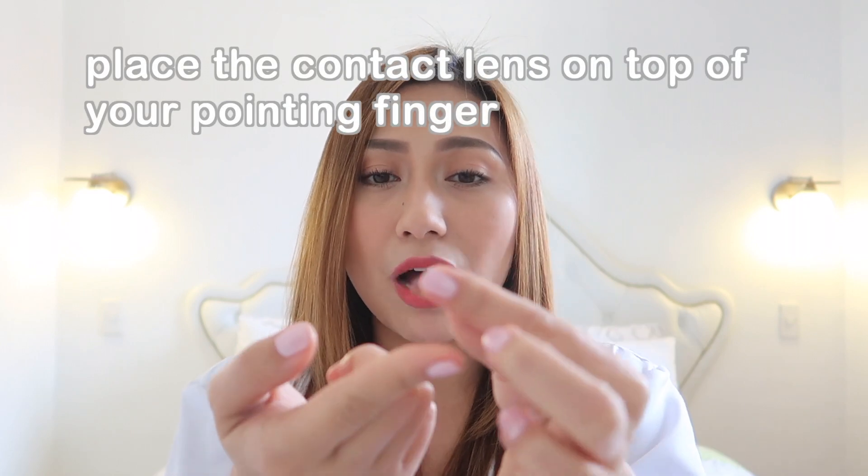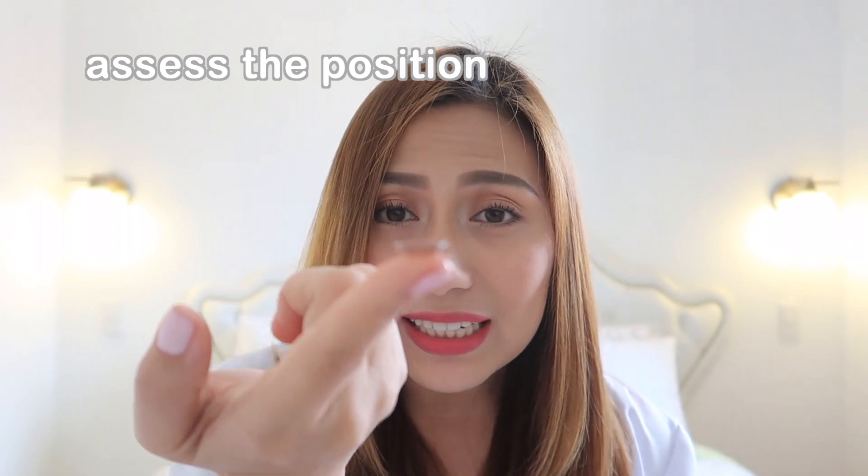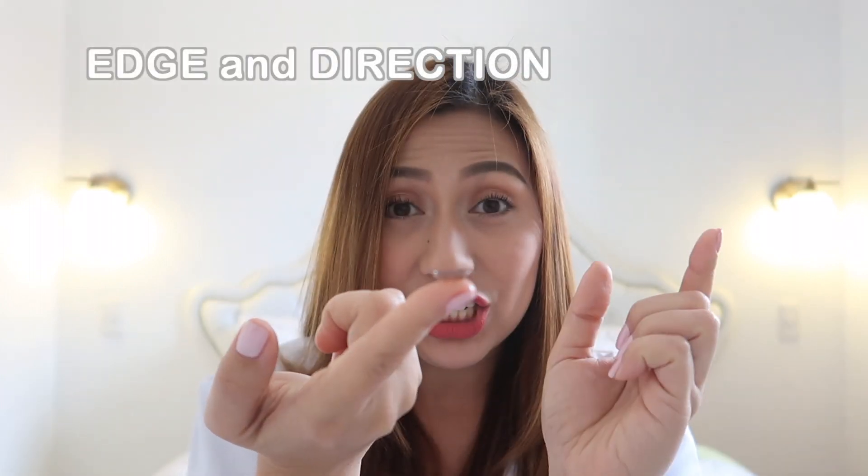First step: put the clean contact lens on top of your pointing finger and assess the position — particularly the edge of the contact lens and its direction. Where is it going? Is it going inward or outward?